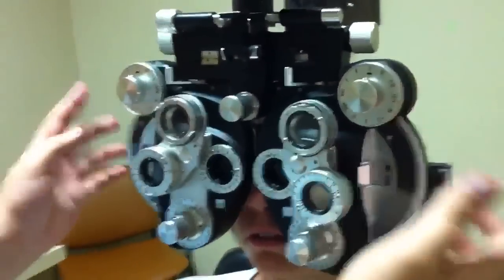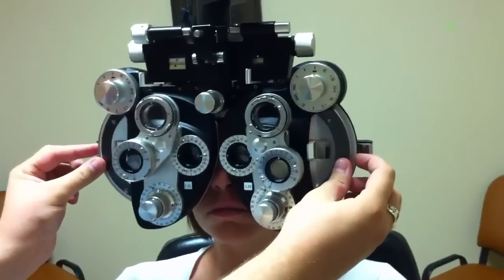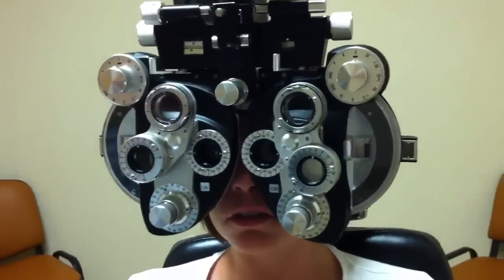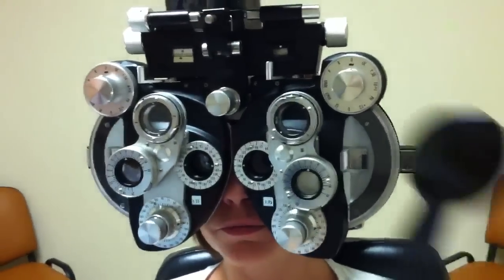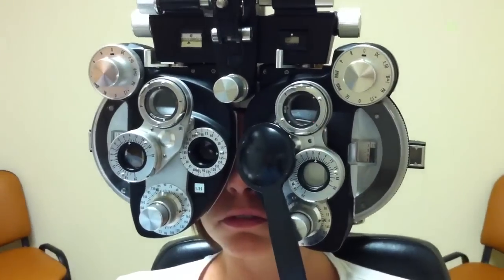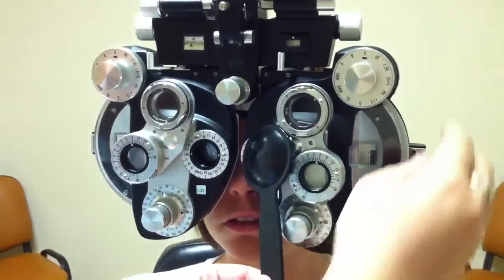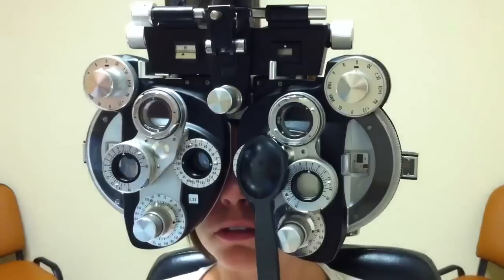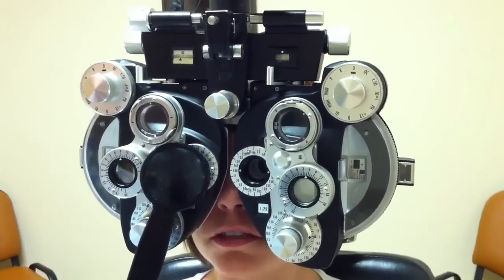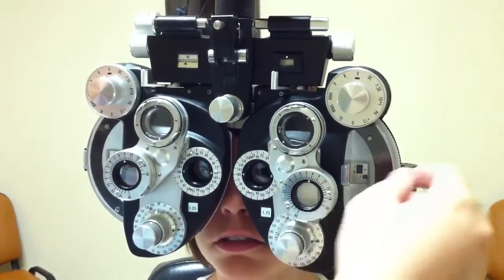I'm going to open up both eyes and add 75 to both sides. A little blurry there? Yes. I'm going to grab my little occluder here, and out of the two blurry views, which looks better — right eye or the left eye? The left eye's better. So I'm going to add 25 to the left eye. Right eye or left eye? Right. Right eye's better. Are you right-handed or left-handed? Right-handed.